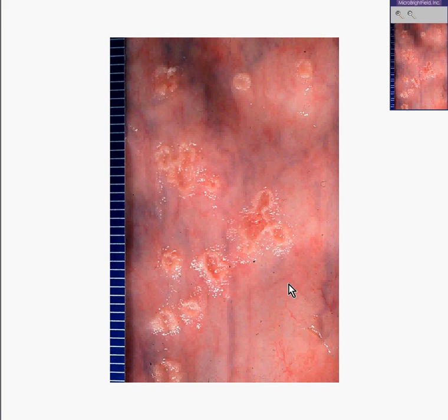You'll also notice that there are areas here and here and here, which look like small ulcerated areas, perhaps slightly elevated, with central areas of ulceration and hemorrhage. And here's a fresher lesion that looks primarily like it has not undergone central hemorrhage or ulceration yet, but has shown some type of mucosal change.